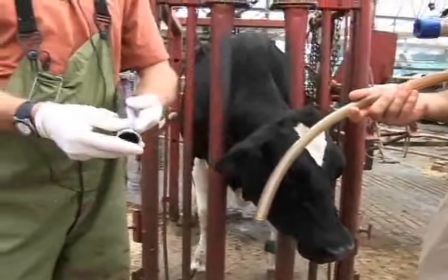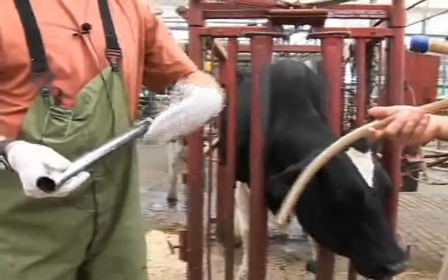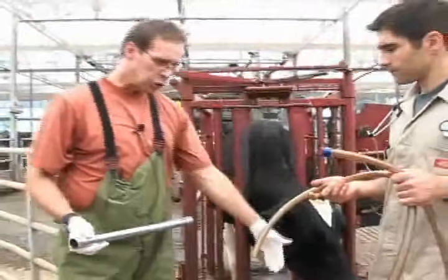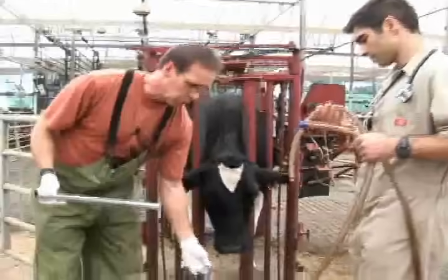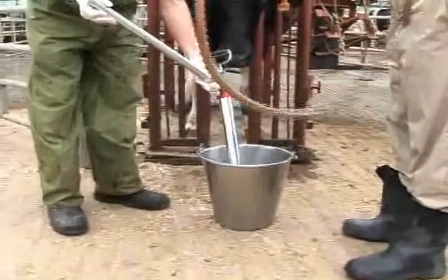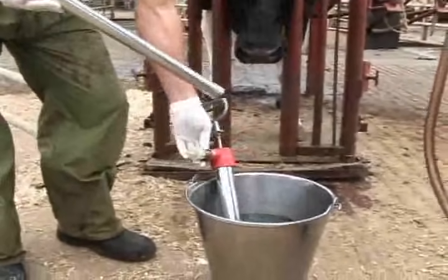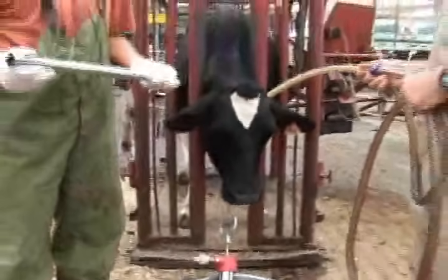So first the Frick speculum will go in place, then the tube will be passed down through the Frick speculum, and once it's in the rumen, we attach the end of the tube to the large volume pump. This pump will actually pump a large volume of fluid through the tube and into the rumen.